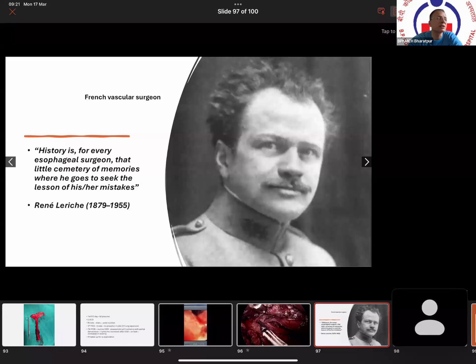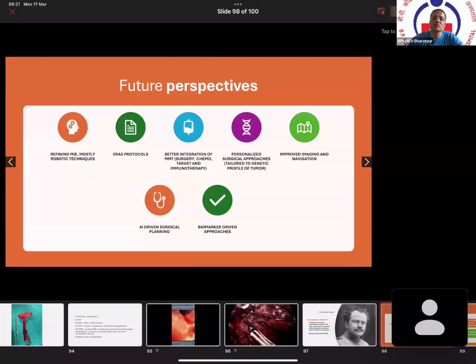We did not realize it during the surgery, but it should be our practice to review the video to see what mistakes we had made during the surgery. Though we did not realize it then, from the next surgery onward, we should be very cautious, even for a minor air leakage that is present during the surgery.